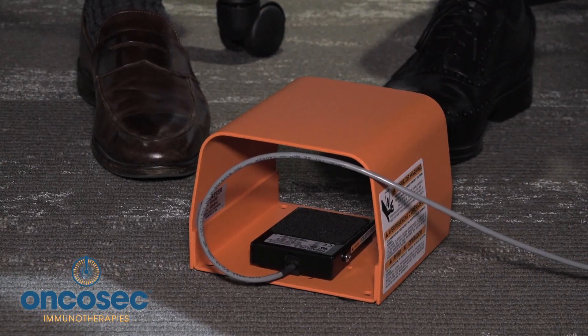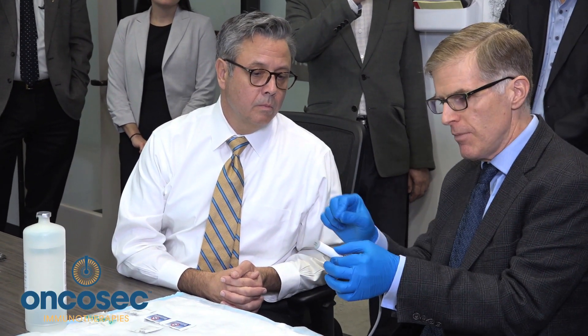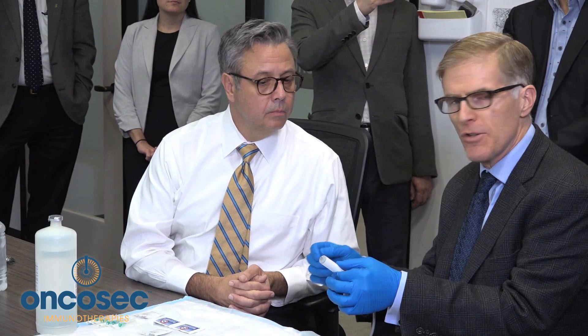The electroporation device is activated by a foot pedal under the table. I'll put my foot on it, the pulses will be given, and that causes the plasmid to be taken up by the tumor. The tumor will then express whatever is on that plasmid for about a week at a time.